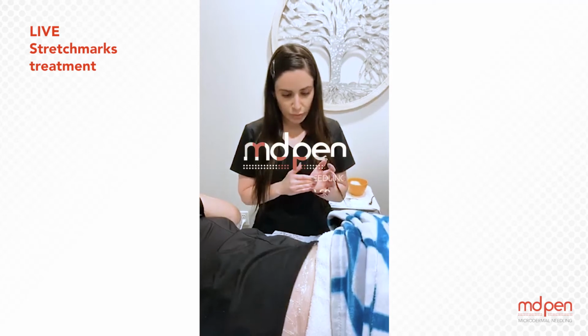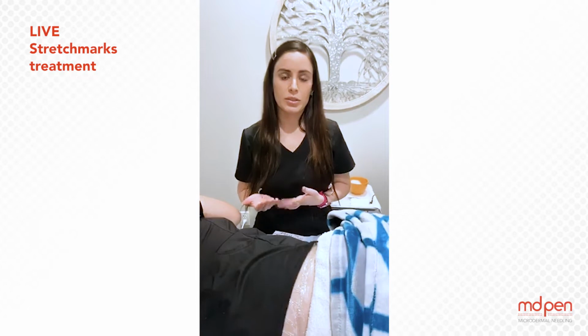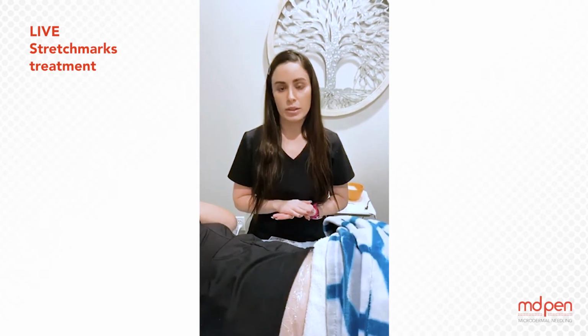When we treat a stretch mark, we want to remember that it is a scar. So if you think of a surgical scar, let's say in dermatology, the incision is done down to the subcu fat layer. So you're working right above the fat. When we needle, we need to be at a certain depth to target the scar. The same goes for stretch marks.